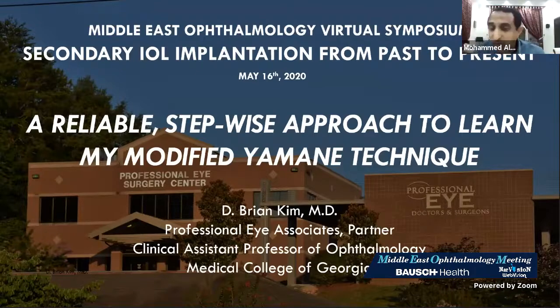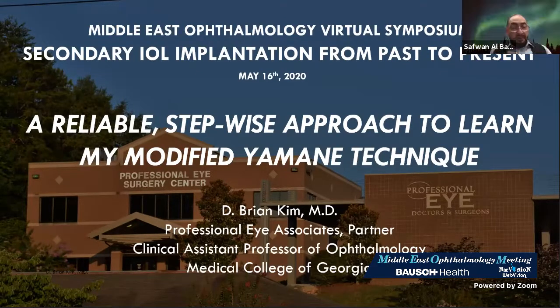If you are taking the trailing haptic and pressing it down more, you might touch the retina. With experience, you will not do it, but there is still a risk when you are pulling the trailing haptic more and putting it down. Yes, Mohammed. Thank you.